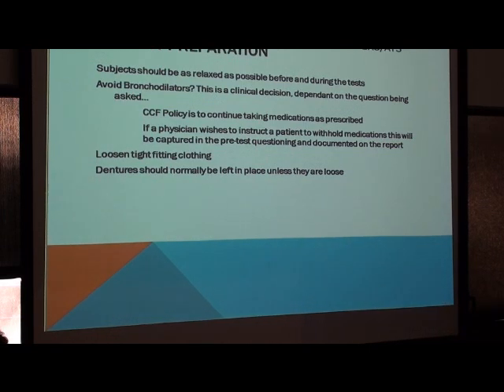So if a physician within Cleveland Clinic Health System really does want that patient's baseline assessment without medications, then they have the option to instruct the patient to withhold their medications before the pulmonary function visit. And as you know, we query the patient about what bronchodilators they're using, and we record that in the technician comments. So that happens all the time.